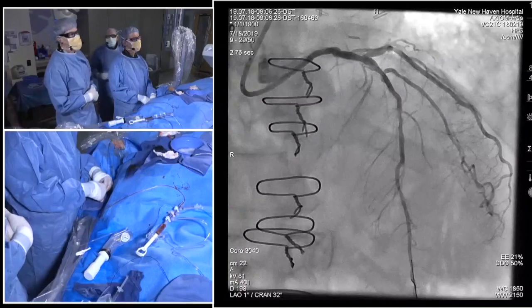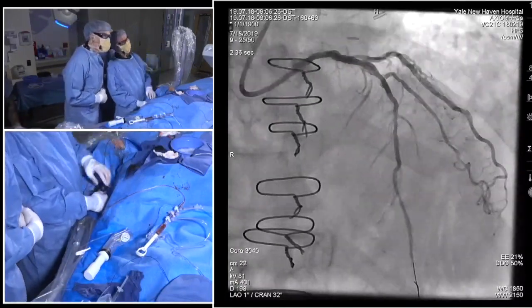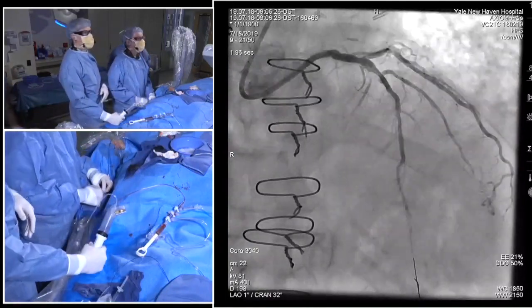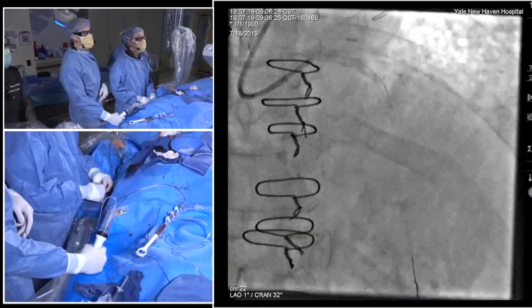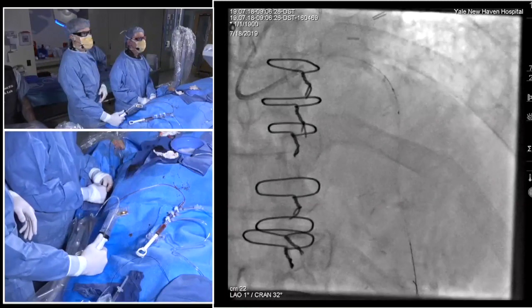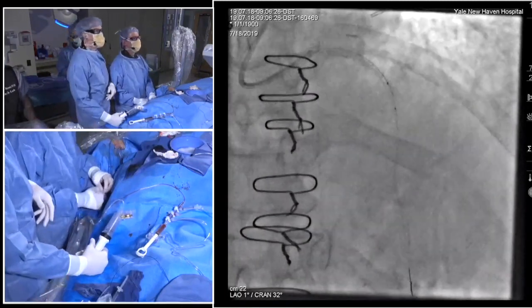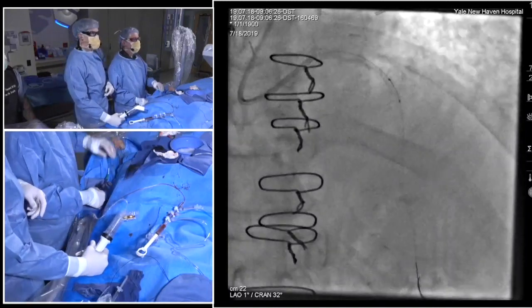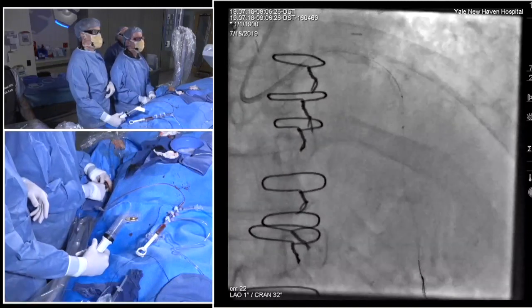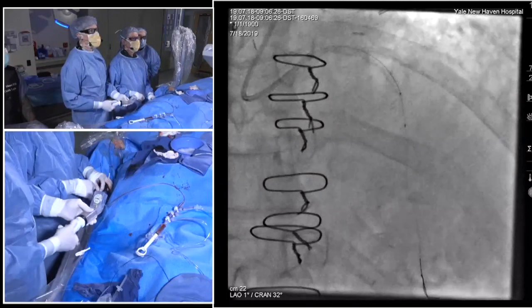And so, in general, even though it may take some effort to get up and into it, it's always better to wire it and at least have it there as a jailed wire when doing the rest of your intervention. I would say, however, that if you look at that angiogram at the beginning, the ostium of that diagonal doesn't seem particularly compromised. No, I think you're right. I think it's definitely a 1,1,0 Medina lesion, but oftentimes having it in there as a marker to protect and a marker to help guide where you're ballooning and stenting can be helpful.